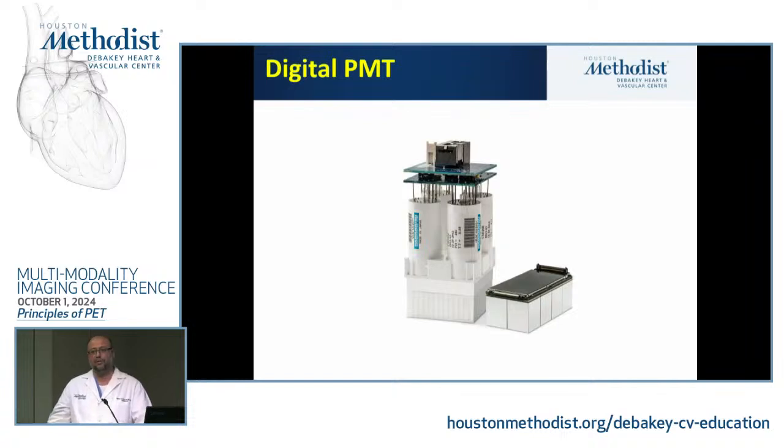So now when you go in the market to buy a PET scanner, there are some that are still analog, but if you want a top-notch program, then you can ask for the digital PET, which has much higher sensitivity. The image quality is very different, and this makes a huge difference in oncology and others, even if you inject a lower dose, you are able to get diagnostic image quality.